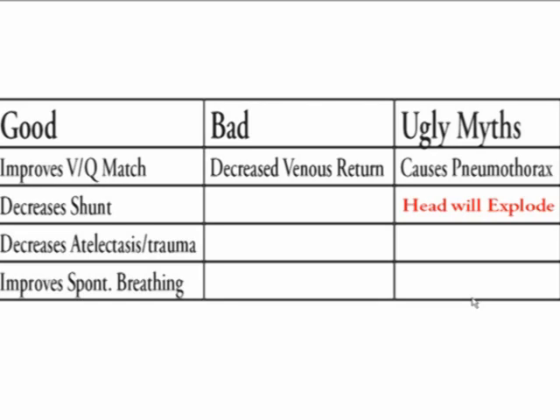It's just like blowing up a balloon. So you're at a kid's birthday party, you have to blow up 50 balloons. When you first start blowing, it's really hard to get air into them. And then once there's some air in there, it becomes a lot easier. Same thing with PEEP. If the alveoli have some air in them, they're much easier to inflate for a sick patient than if they're empty.